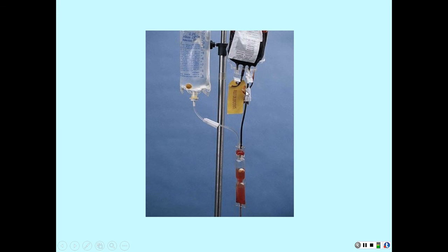All right? And leave open the one that you want infusing. The one down here is handling your rate, or your pump is handling your rate. But the blood will immediately start to infuse once you open it up. So that's what a Y set looks like. When your blood has transfused and your bag is empty, you're going to close this one, open this one, and let this flush out your tubing, flush out your blood.